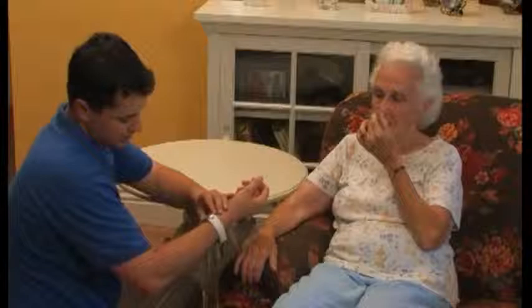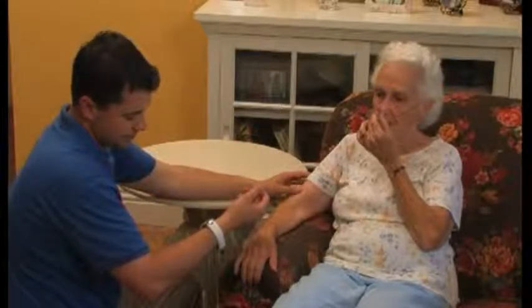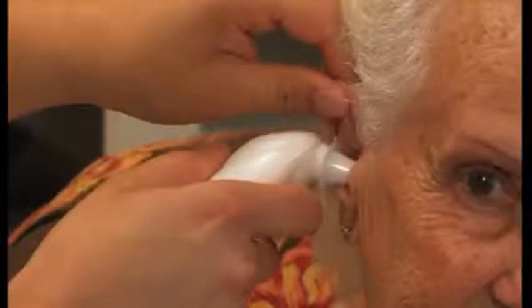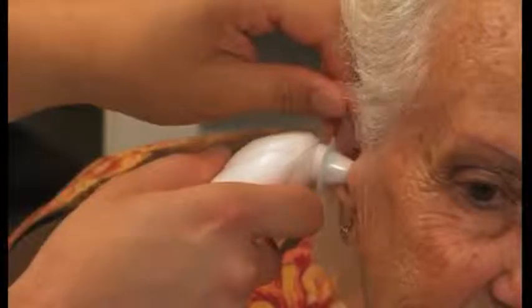Our residents that have any impulse control issues or confusion, for example, our residents with dementia, would be at significant risk if they bit down on a thermometer. That's why we have tympanic and other thermometers that are actually more safe to use with our residents that have any level of confusion. Let's talk now about obtaining a temperature reading orally.